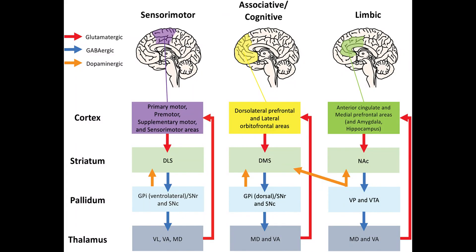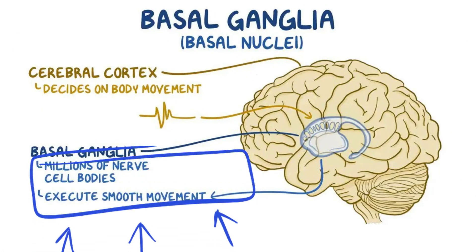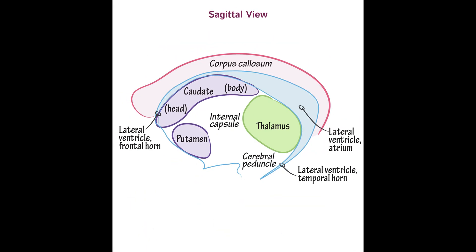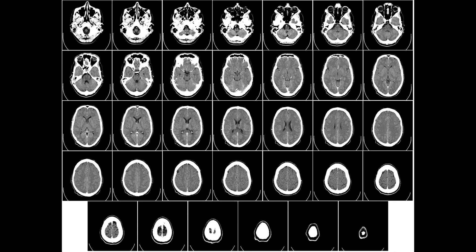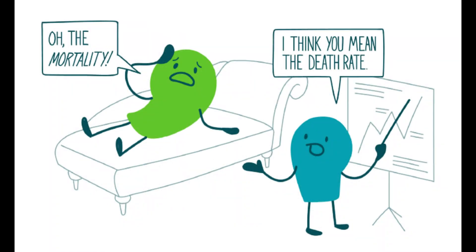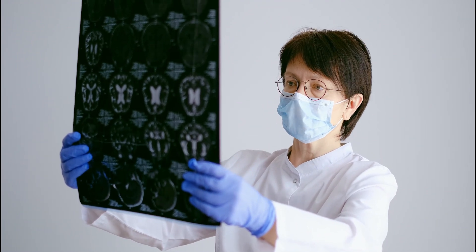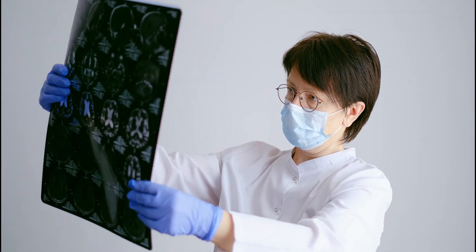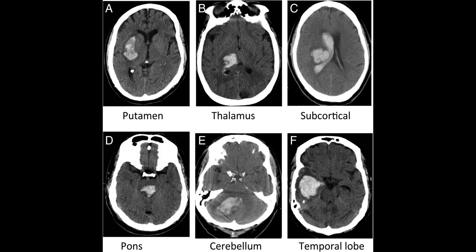Basal ganglia are very important anatomical structures that are associated with many functions, but their major role is to facilitate movement. In this video we are only discussing the anatomy. This was all about how you can identify the Deep Brain Nuclei on a CT scan, as it is the most common site of supratentorial hemorrhage and is associated with a 50% mortality rate. Being a medical student, junior doctor, intern, or resident, you should know that this is the typical location of hemorrhage in a hypertensive patient.